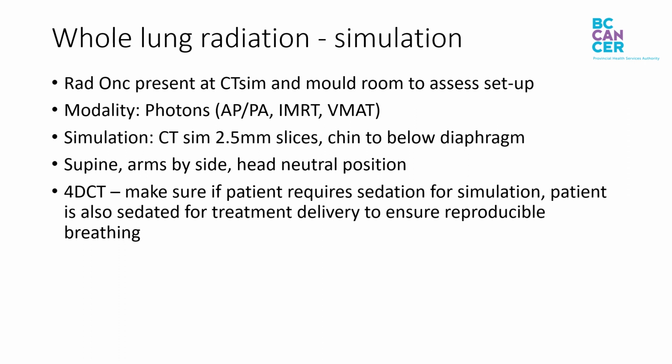We also use simulation CT scan with 2.5 millimeter slices, chin to below diaphragm, supine, arms by side, and head in a neutral position. And of course, we acquire a 4D CT scan and make sure that if the patient requires sedation for simulation, the patient is also sedated for the treatment delivery to ensure reproducible breathing.